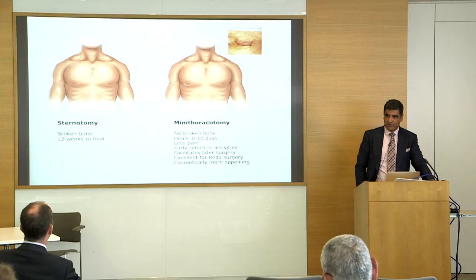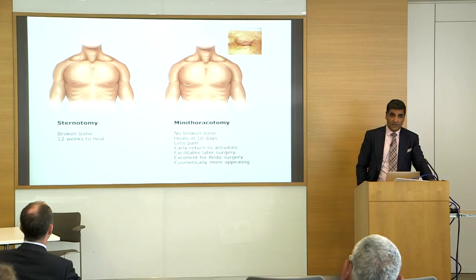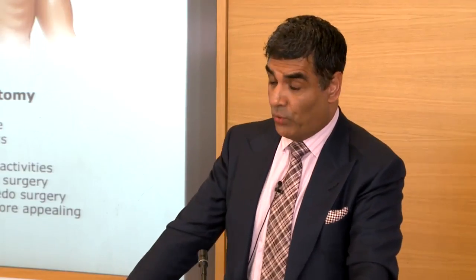We started with a small thoracotomy and a small retractor, moved on to soft tissue retraction, and now for males we will use a circumferential areolar incision. For ladies, we don't really like to cut through the breast tissue, so we'll go underneath. I think that's dictated how we've wanted to do the surgery, and that's why IntraClude, in my view, has taught us in the second attempt at using that technology that it really is the only way we can minimize the incision in minimally invasive mitral valve surgery.